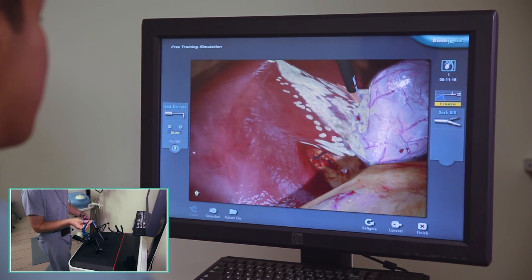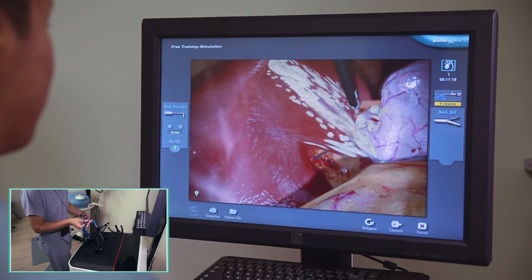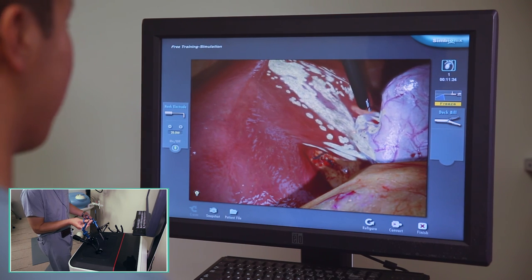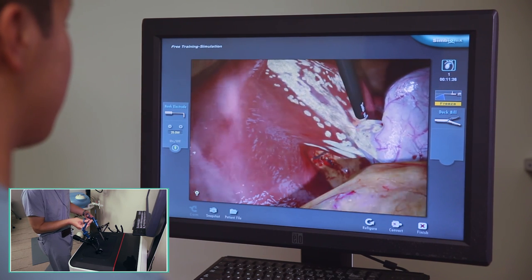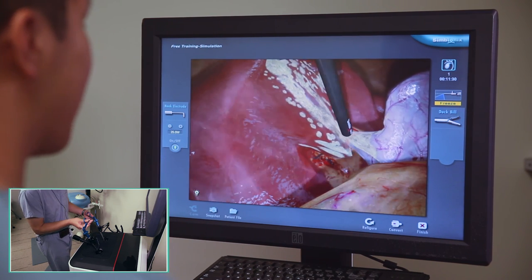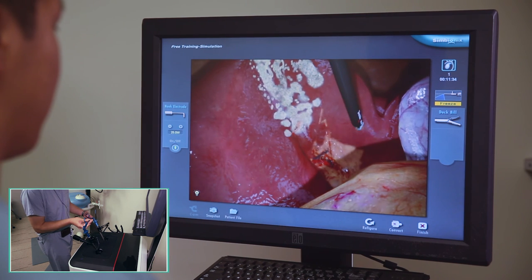You can play around with this section and do it whatever way fits you. I've just found this is the easiest way, from my perspective, to take the gallbladder off the surface of the liver — always staying in that technically avascular plane between the gallbladder and the liver. And we've freed it up.